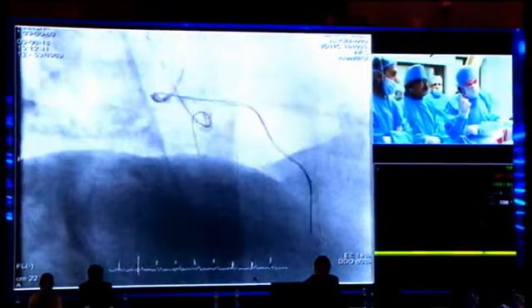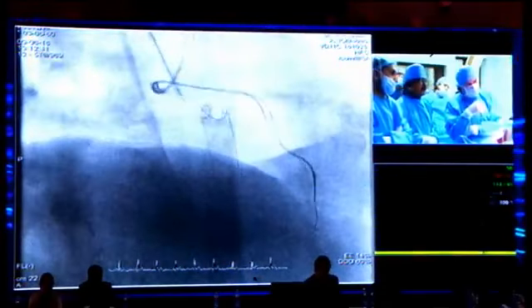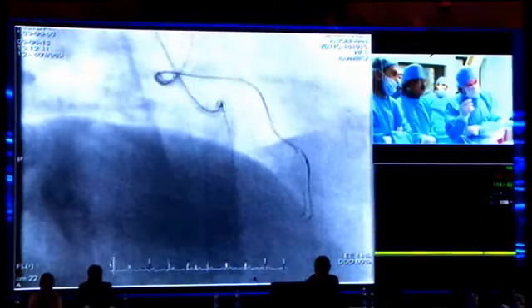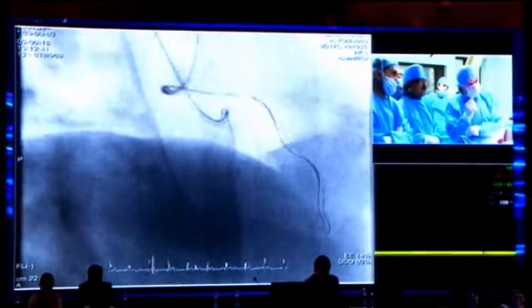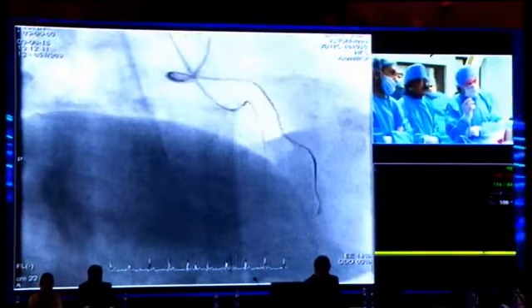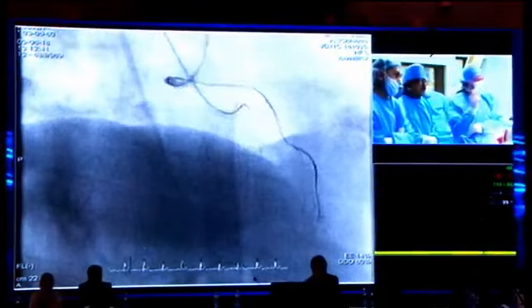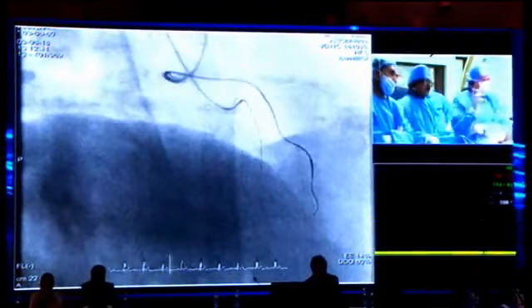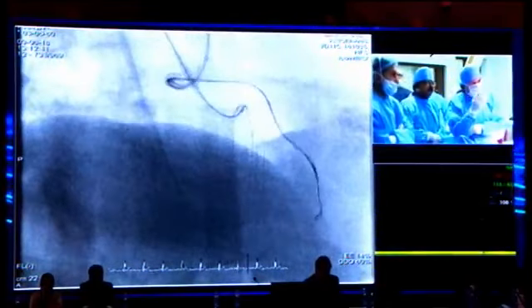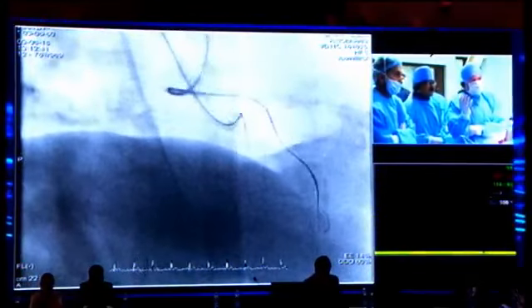I turned clockwise here and waited for the wire for the heartbeat, not forcing it, but just turning it and seeing whether the tip gets caught by the heartbeat. It still takes some time, but it should be shown that it is not a thing of 10 seconds.